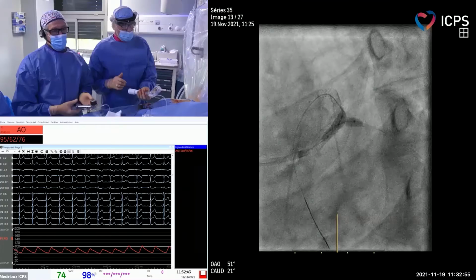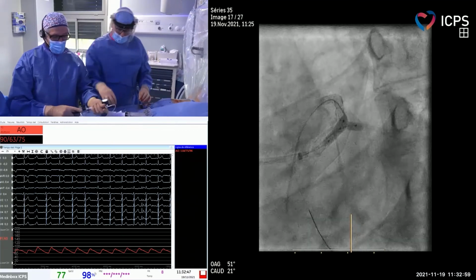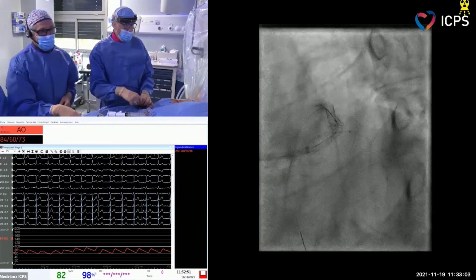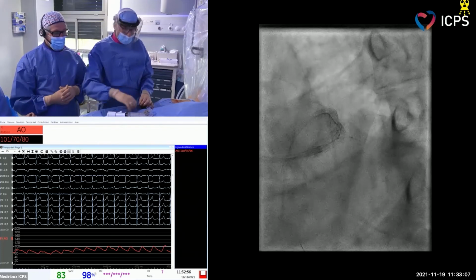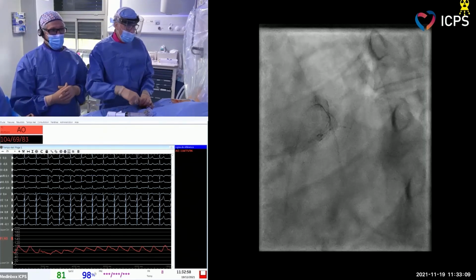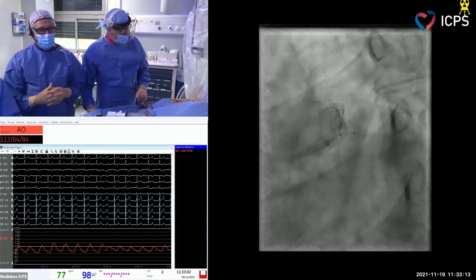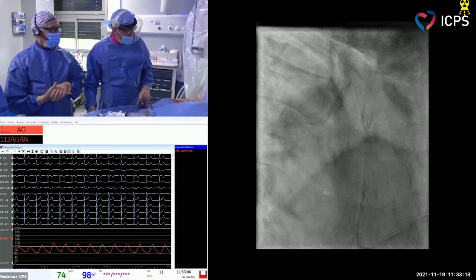I think we need a randomized study. We are waiting for this. I think it's very important. We have done some studies, but it was not randomized, showing that at long term, we have good result in the side branch after kissing balloon inflation, and it does not promote restenosis. So it's not damage, just opening the strut toward the big branch.